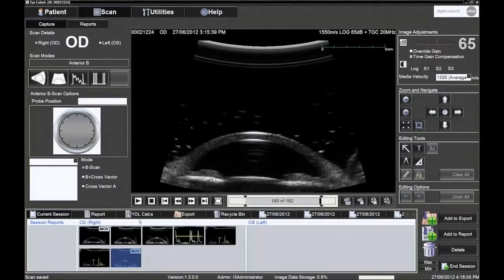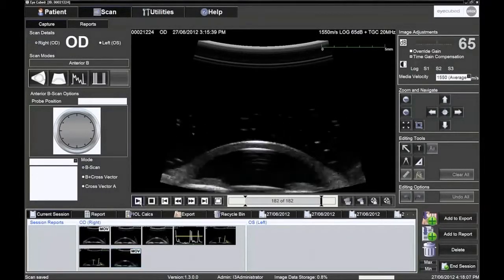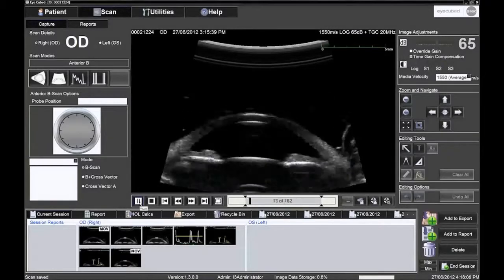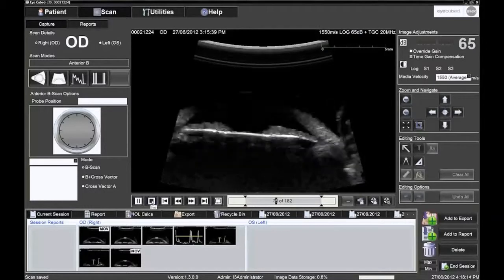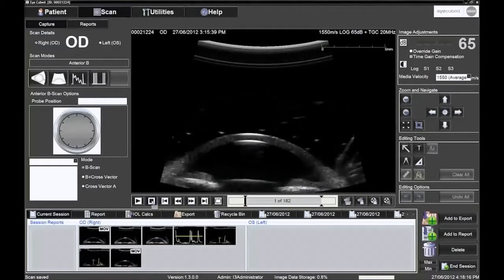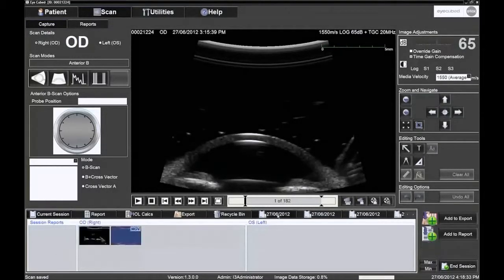The pictograms on the lower left of the screen control how to play the movie. Hovering the cursor over the pictures displays each button's function. Images and movies in the image tray can be reloaded for further examination by double-clicking to load. It is also possible to examine images from a previous session performed on the same patient.